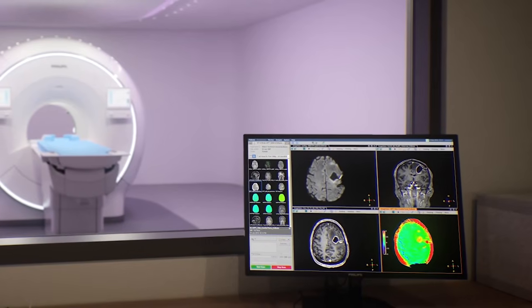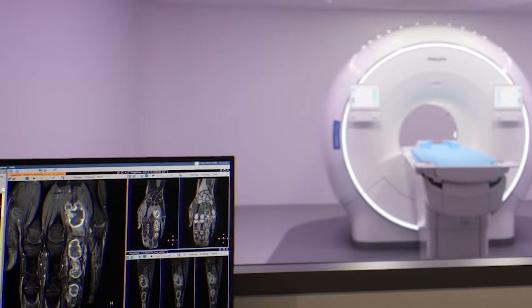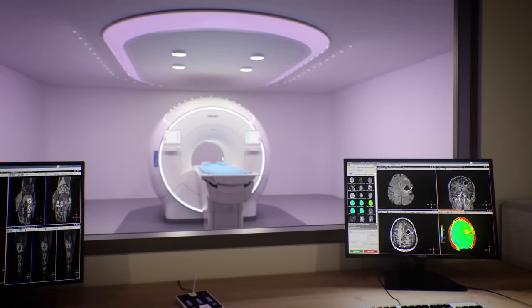A lot of these pains are long-term peripheral neuropathies or some sort of neuritis. They've had previous imaging, sometimes of other modality like ultrasound, and there's no structural reason for this to happen. I think the sensitivity of the nerves to show bright signal from neuritis or neuropathies in the sequence is quite sensitive, and there's been multiple recent occasions where we're getting true answers that fit the clinical story to the patient and give the referrers and the patient a lot more confidence that we're actually localising exactly where their problem is.